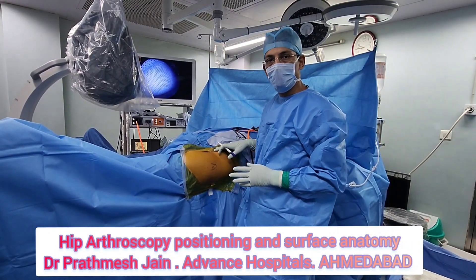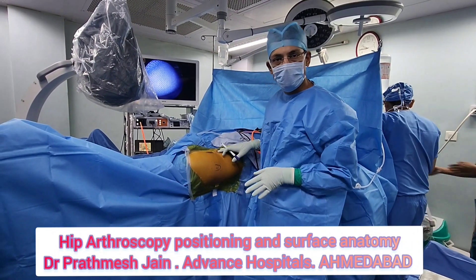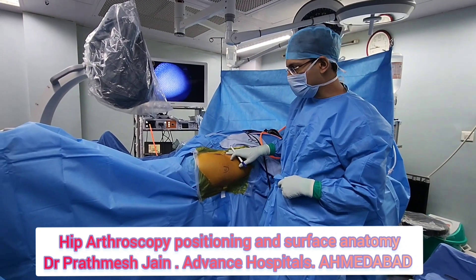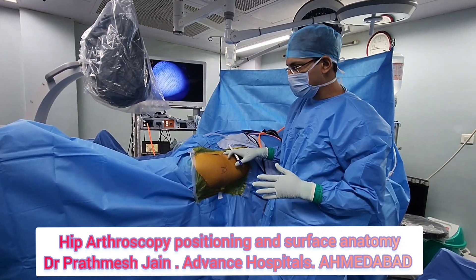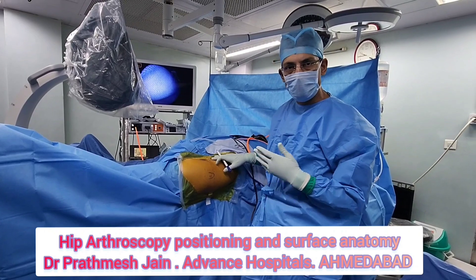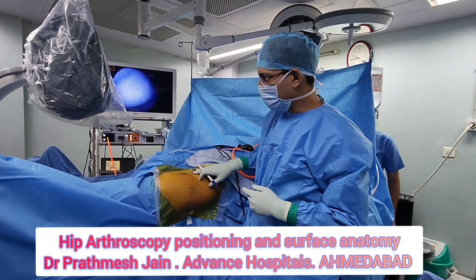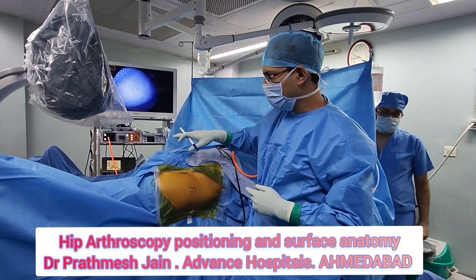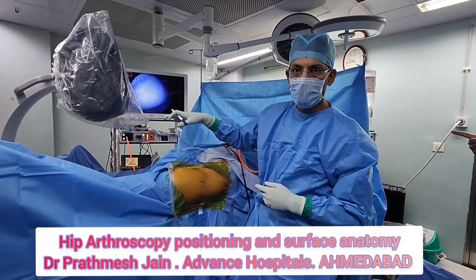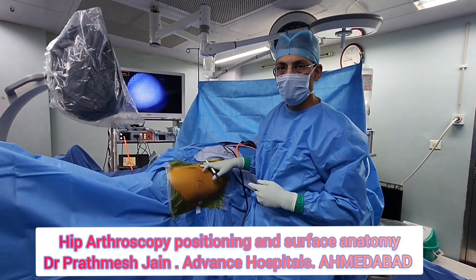Friends, we are demonstrating the positioning and the surface anatomy of hip arthroscopy. In a hip arthroscopy, the patient is placed on a fracture table like you do for any fracture surgeries. The other limb is abducted to allow the C-arm to enter into the space.